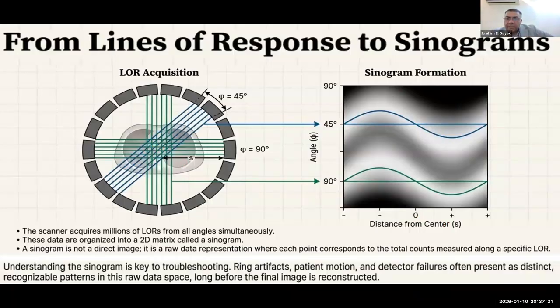This is actually the sinogram, and like we said, it is a 2D representation of the lines of response, which will let us create the image later.